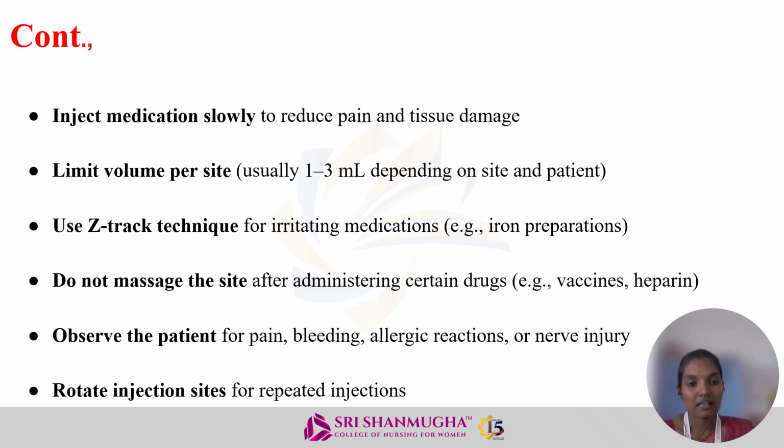Use the Z-track technique for irritating medications, for example, iron preparations. Don't massage the site after administering certain drugs, for example, vaccine and heparin. While we administer these, we don't massage the site. Observe the patient for pain, bleeding, allergic reactions or nerve injury. Next one, rotate the injection site for repeated injections.